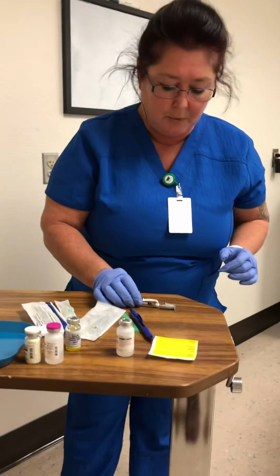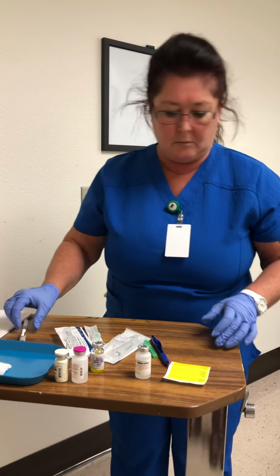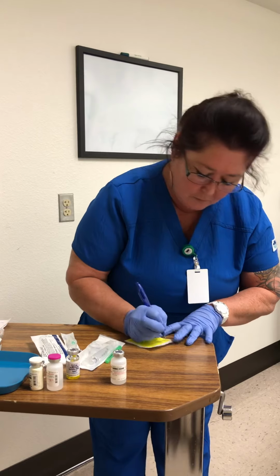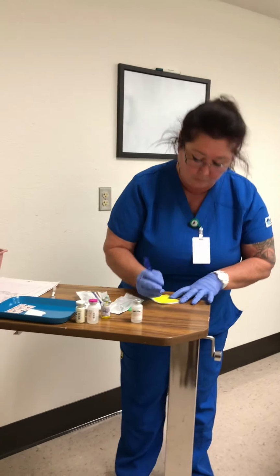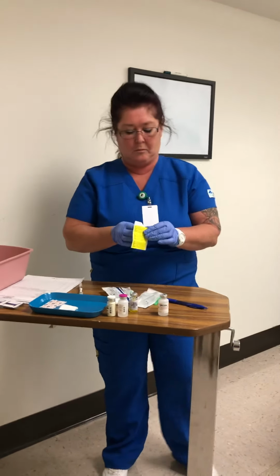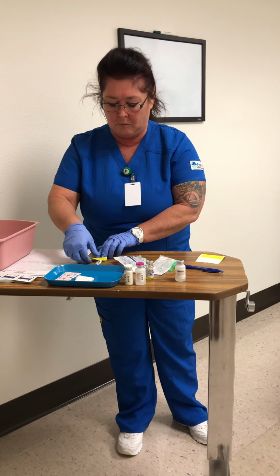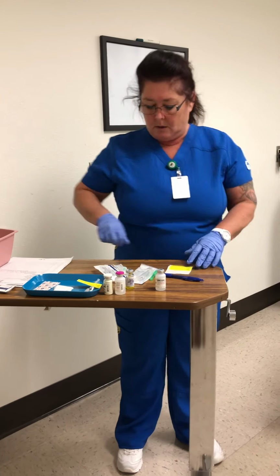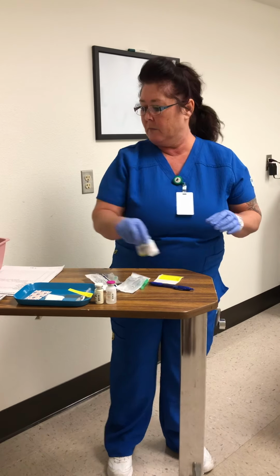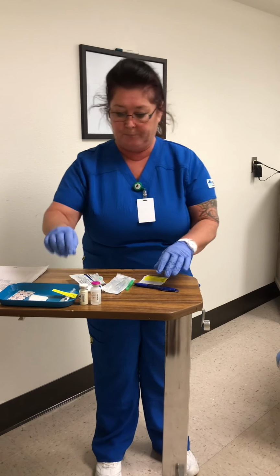I am going to recap. And I'm going to tag. And then I'm going to place this on my tray. And, okay. So I would dispose of those in the proper way.